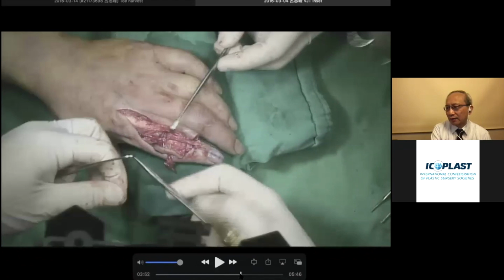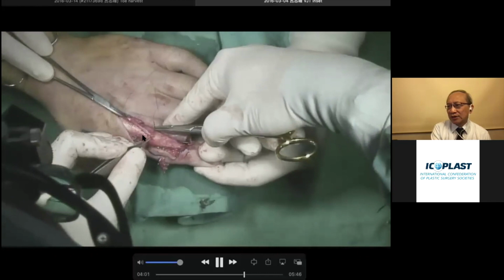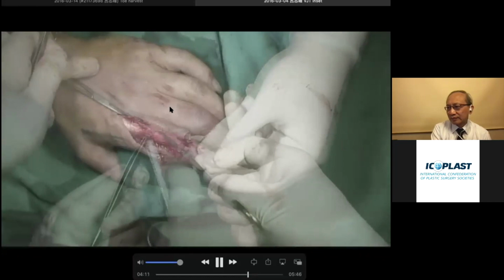After that, I will do the interweaving of the extensor tendon. So at the center of the extensor tendon, then pull the EDL across the central part of that, the mattress suture, and I'll do two weaves of that. Second weave.